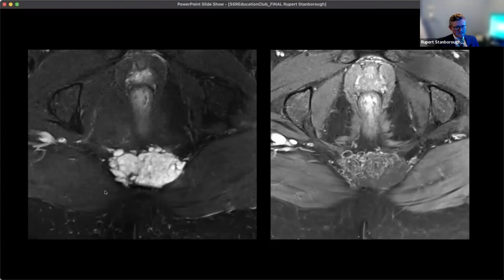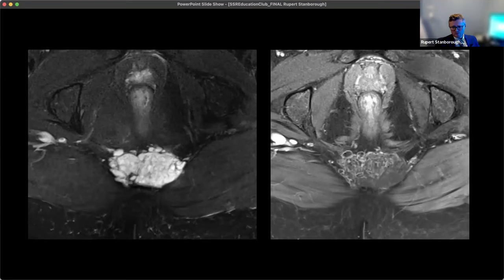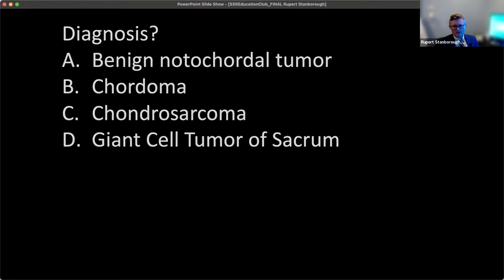On oblique axial images, the tumor is definitely expanded outside of bone, T2 bright with little septations — not a cyst. Post-contrast shows lumpy, bumpy peripheral nodular enhancement. Notably, it's located in the midline. What's our diagnosis? Is it A, benign notochordial cell tumor/remnant? B, a chordoma? C, a chondrosarcoma? Or D, a giant cell tumor of the sacrum, reportedly the second most common sacral tumor?